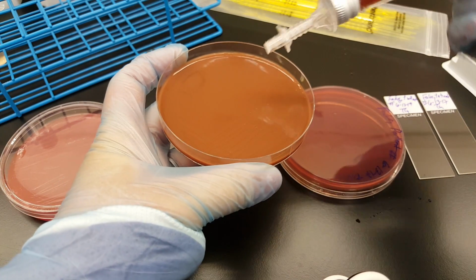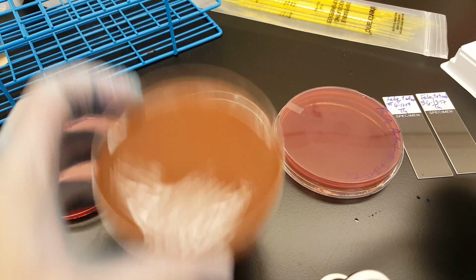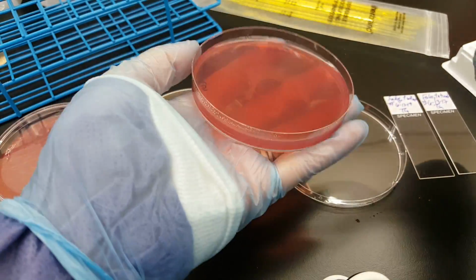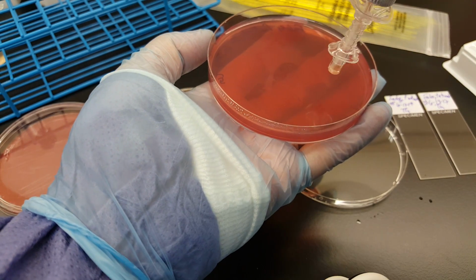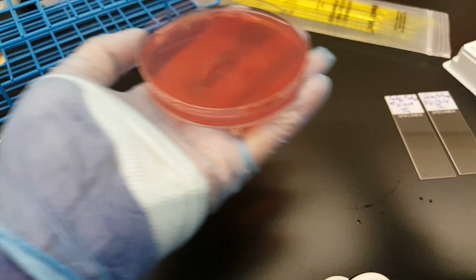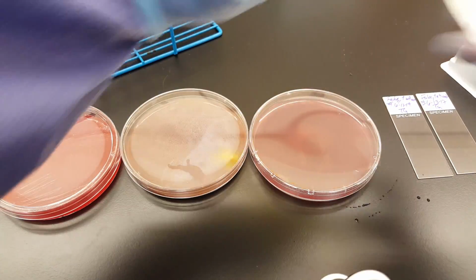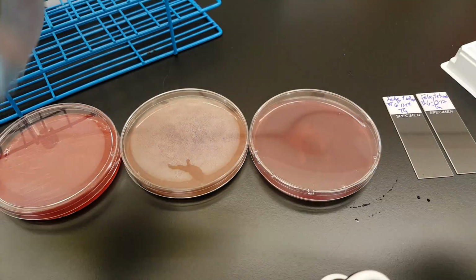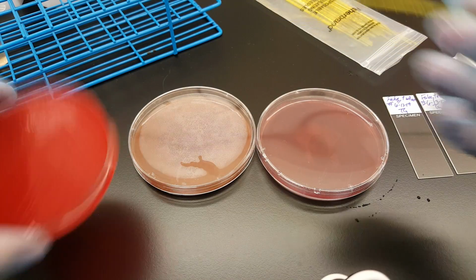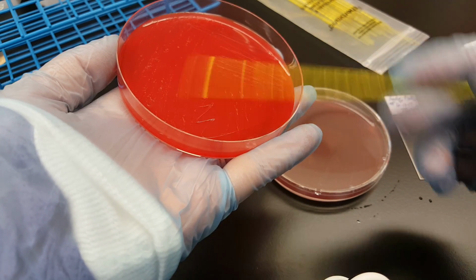So the next one I'm going to do for 1 quadrant, and I'm going to leave it face up. Same with the last one, the McConkey plate. And put this down, leave it face up. And so now I'm going to get my inoculating loop, and I'm going to streak them out, doing the 4 quadrant method again.